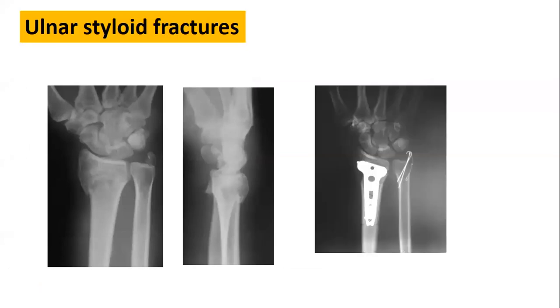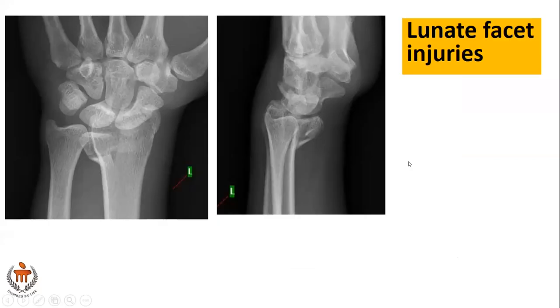If you really want to fix this, it always probably needs to be a mini open kind of an incision here. And it's always under vision, you fix these fragments. You can't blindly percutaneously do this kind of a fixation in these fractures.